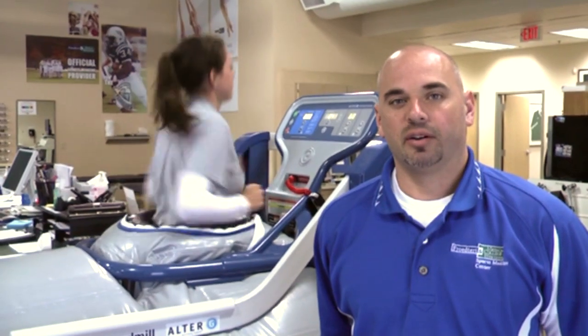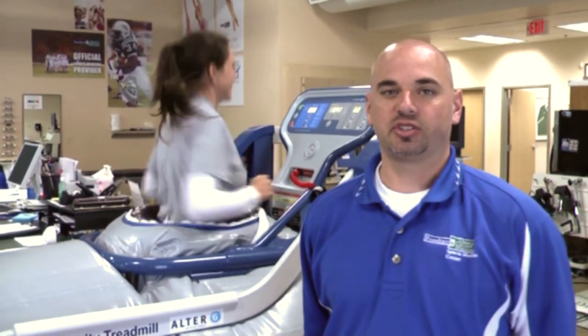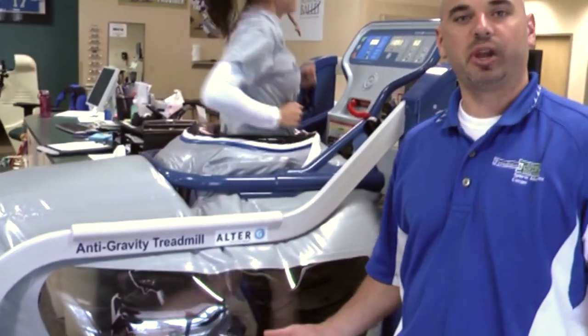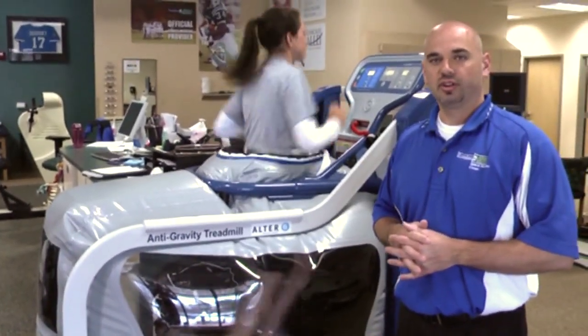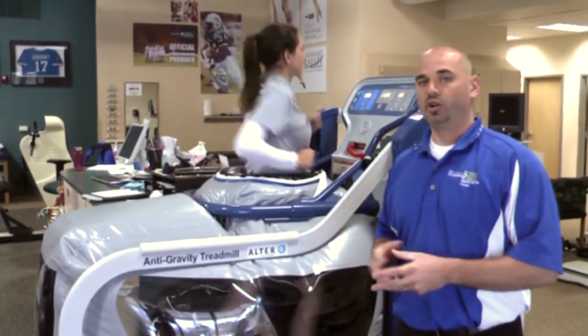This is the Alter-G anti-gravity treadmill, used for physical therapy patients as well as performance enhancement patients. What this machine is doing is pumping air into an air chamber, which actually lifts the patient up and provides some weightless features. Right now she is running at 80 percent of her body weight.